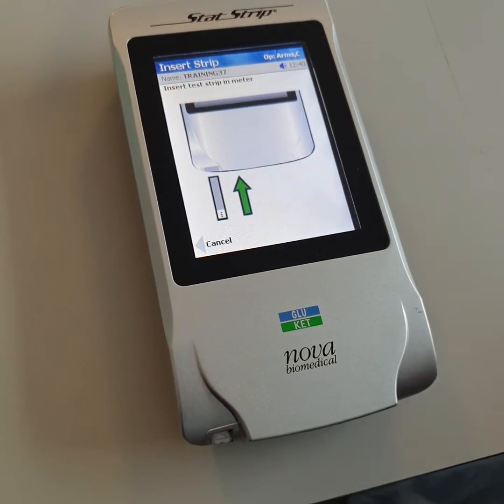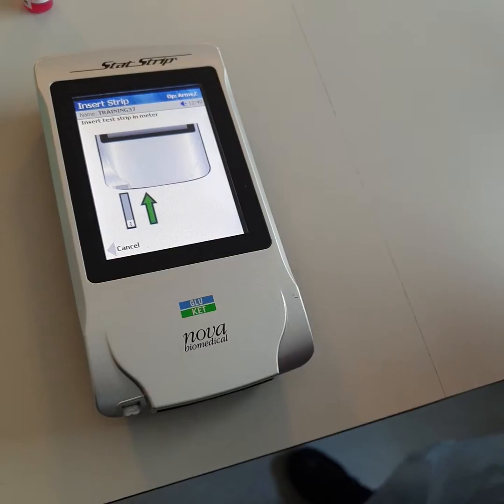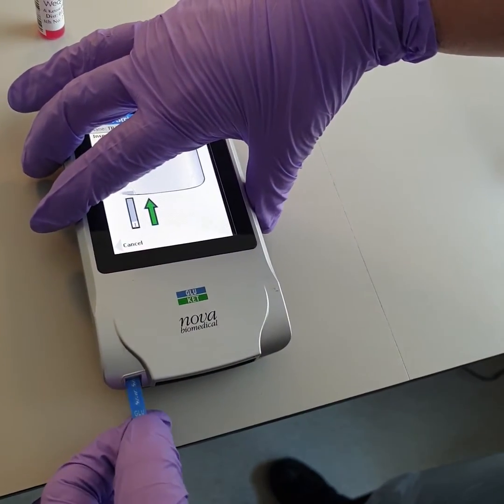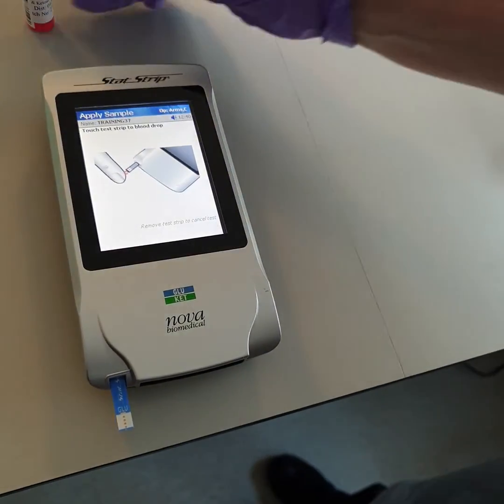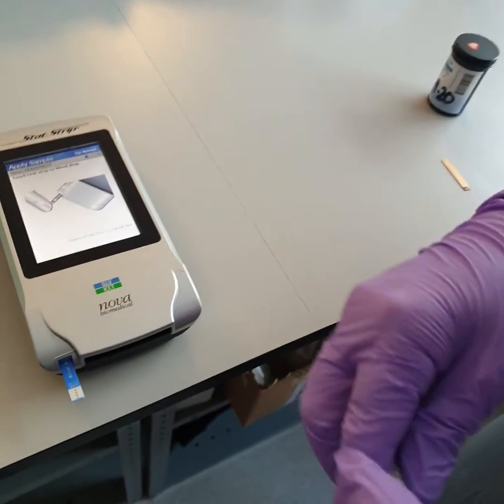The meter has to be on a flat surface. Insert the strip the correct way — the chip goes in the port.